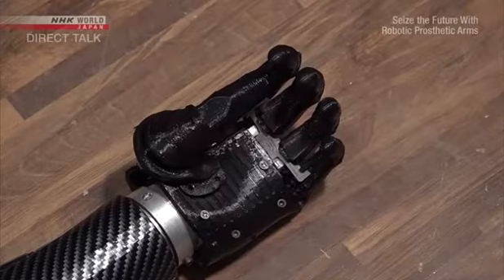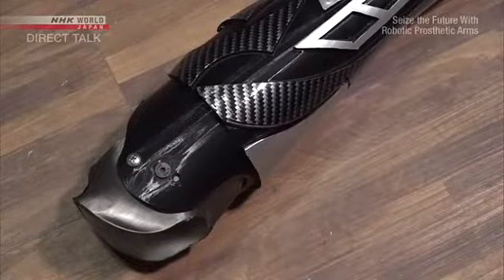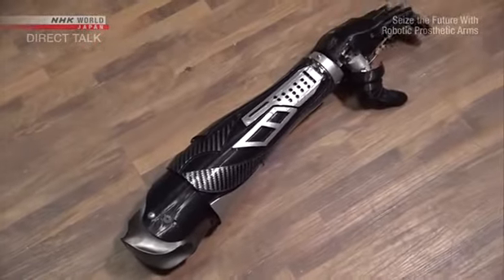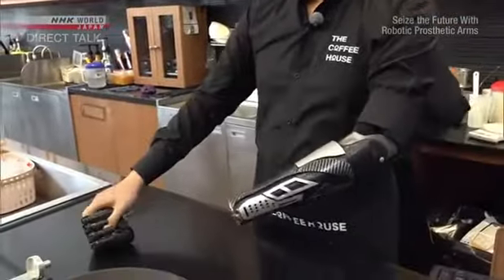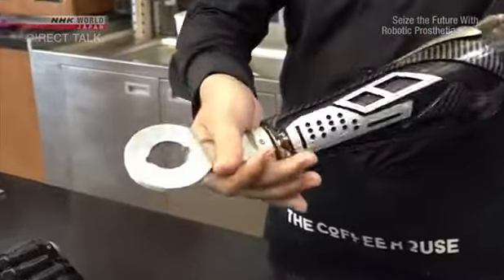Trịnh Khánh Hạ leads a team of engineers and designers as the general manager of a robotic prosthetic arm company based in Vietnam. Make a little sticky thing to put into the sensor box. This is a robotic prosthetic arm which her team has developed. The uniqueness of it is that the modules can be changed depending on different uses. This prosthetic arm can be specialized for waiters by replacing the daily use module with a waiter module.